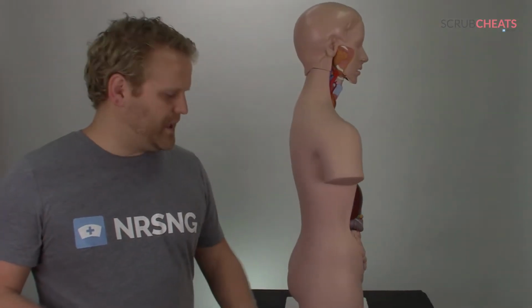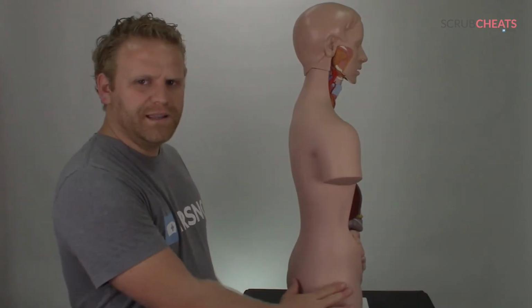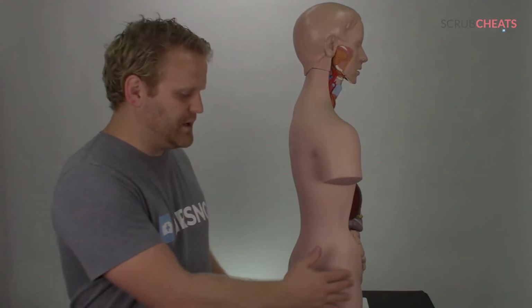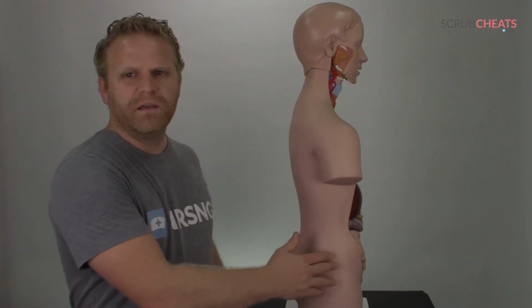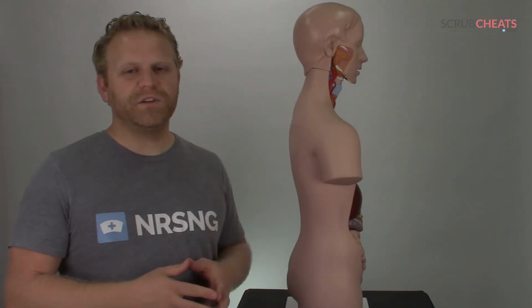To locate the ventrogluteal, place the palm of your hand over the greater trochanter with your middle index finger pointing at the iliac crest and the index finger toward the anterior superior iliac spine. Both of these sites can take up to 3 mils of medication with a 1 to 1.5 inch needle, depending on the size of your patient.